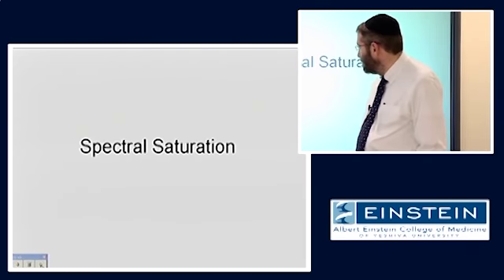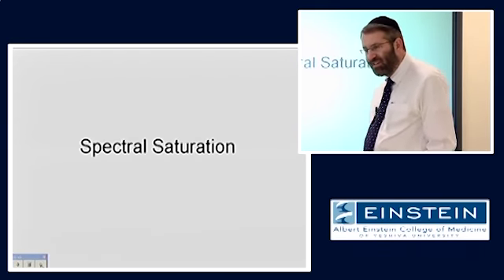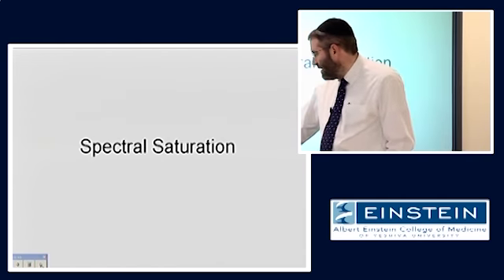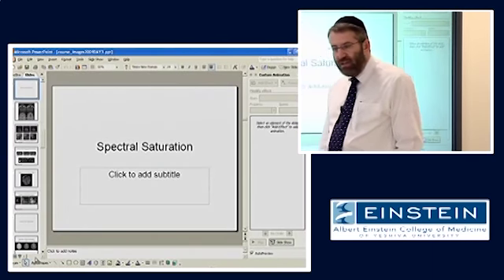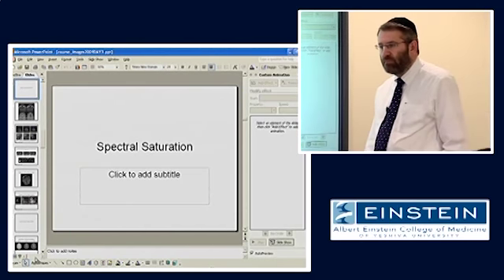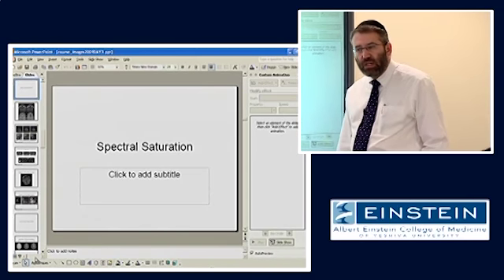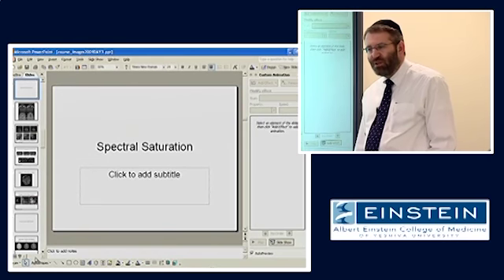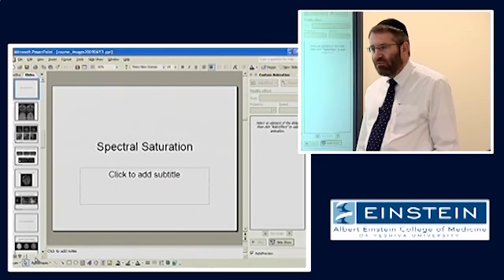Can we now routinely recommend T2 FLAIR images to rule out subarachnoid hemorrhage? So if you ask me, I think it's a more sensitive test. And it's been studied somewhat. Like everything else in radiology, there are really no good large studies, but the data that's out there seems to show that it doesn't really miss. But it will be affected by the age of the subarachnoid? Definitely. It's only for acute subarachnoid.